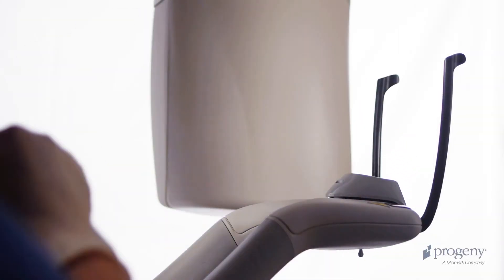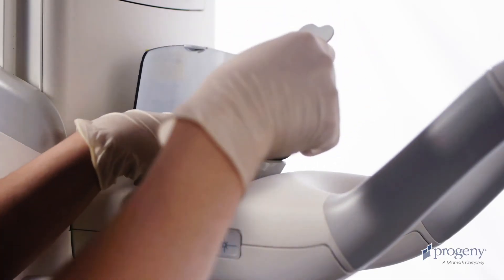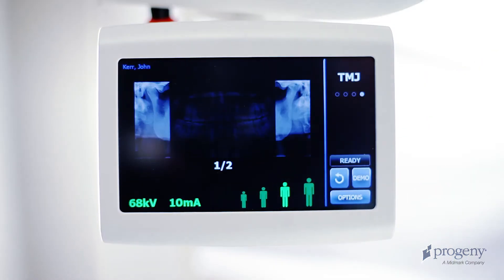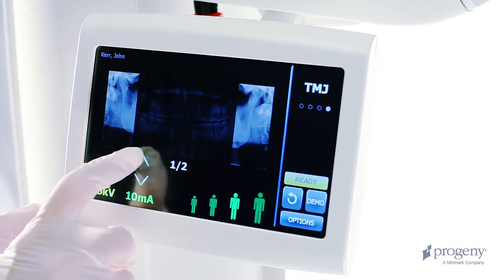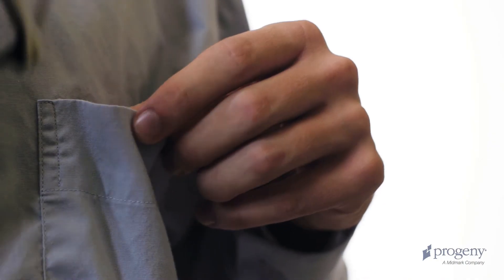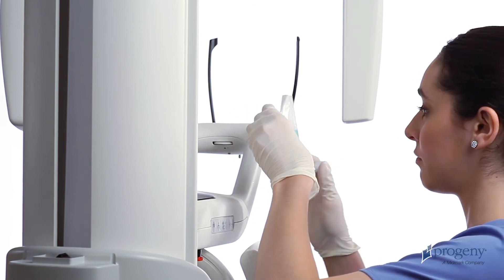To perform a TMJ examination, first exchange the panoramic bite piece and chin rest for the TMJ positioner. Choose the TMJ exam on the control panel. Verify the technique according to patient size and anatomy. Explain the examination process to the patient. Ask the patient to remove glasses and jewelry. Place the sanitary barrier on the positioner.